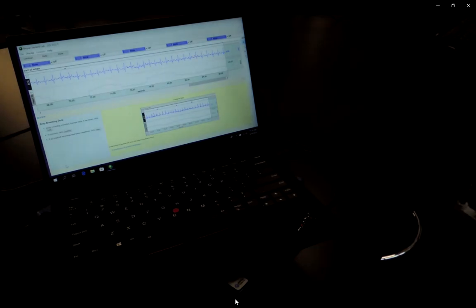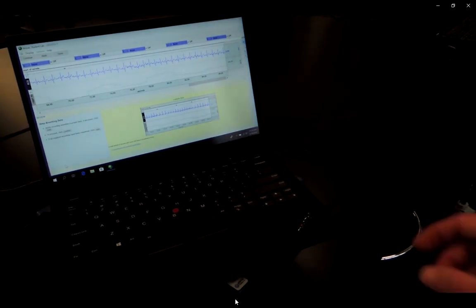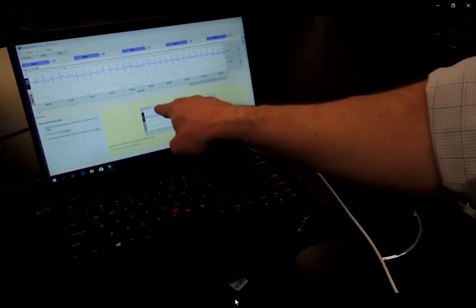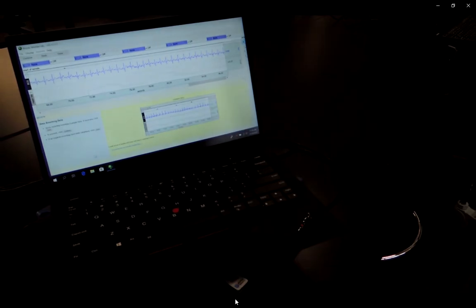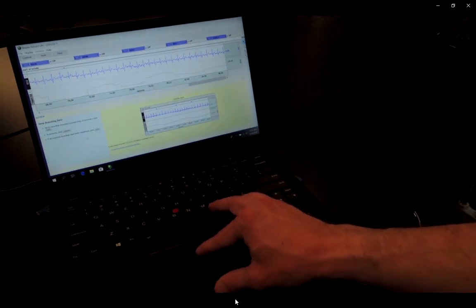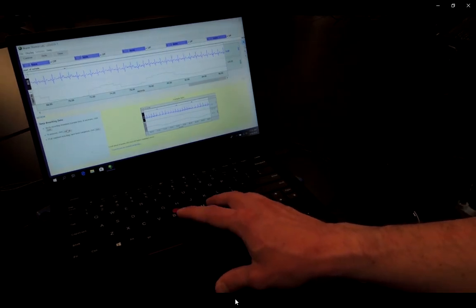Okay, we'll go ahead and click suspend there. What we can't see from the computer screen here, but on our example data and here up above, we have some arrows that show up. Those arrows indicate when we had an inhale and when we had an exhale. So we've got some good data here. We'll go ahead and continue as we proceed there.